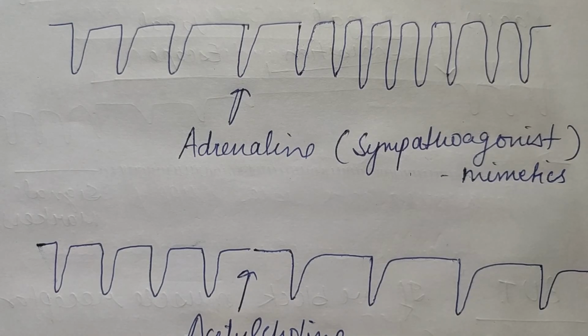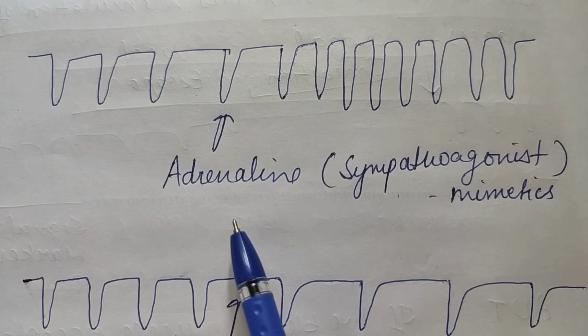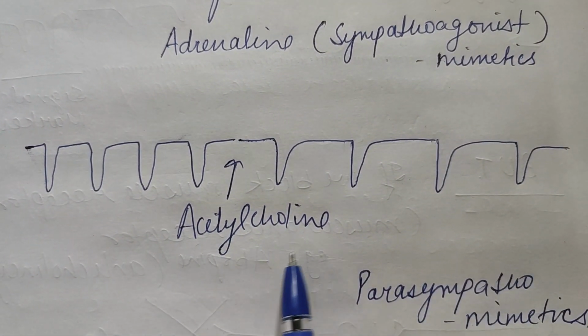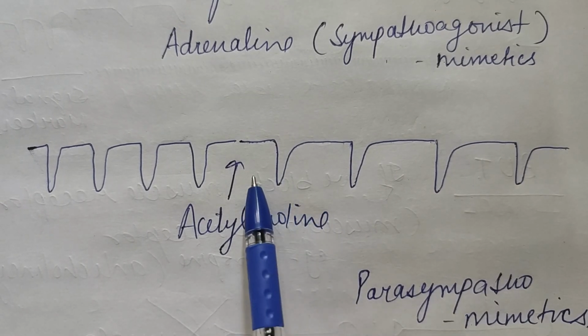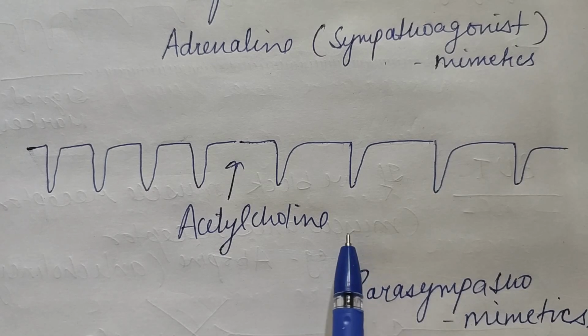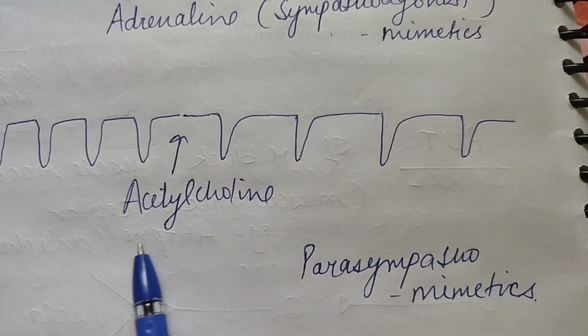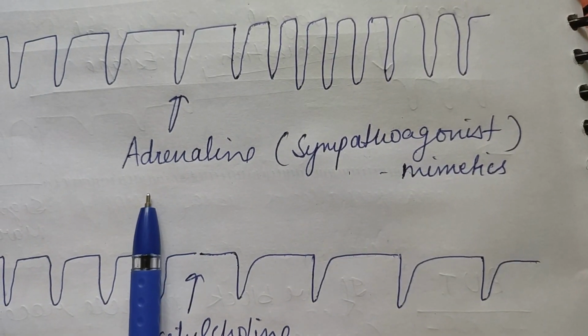just to finish all the amphibian experiments, the last thing left is, we have seen that parasympathetic fibers, whenever stimulated, what they did is decrease in heart rate or cardiac arrest, vagal inhibition, right? So we know now that the parasympathetic system decreases the heart rate and the sympathetic system increases the heart rate.